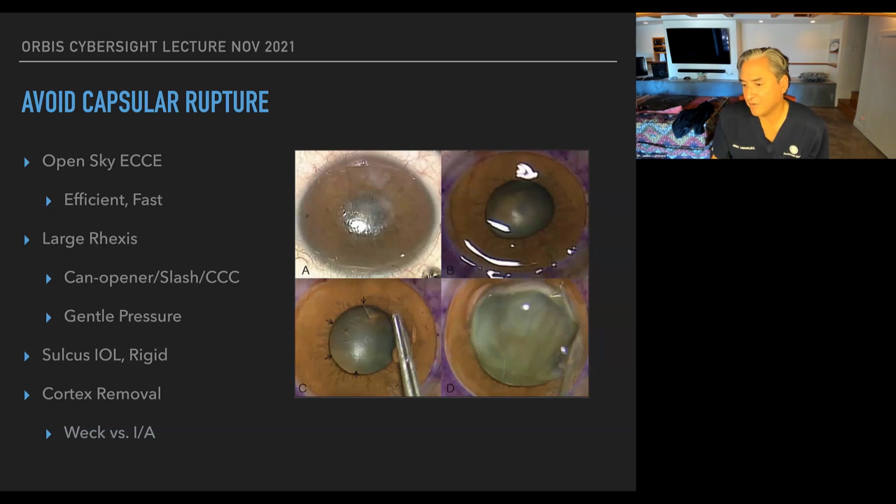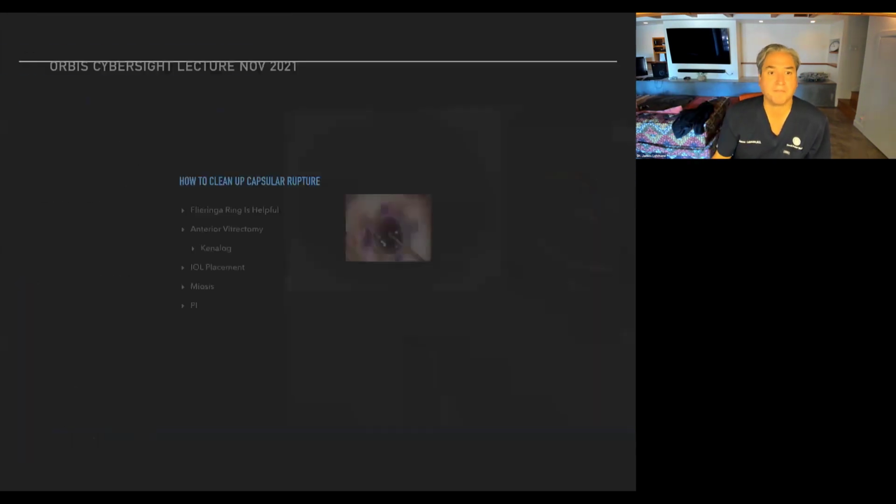So it's a little easier to do a vitrectomy. Dr. Mathen asked, regarding oversizing, is there a rule for keratoconus? I do 0.25 for everyone. The only difference I do in keratoconus or pellucid is I'll make a shelf inferiorly so that you have easier suturing time.